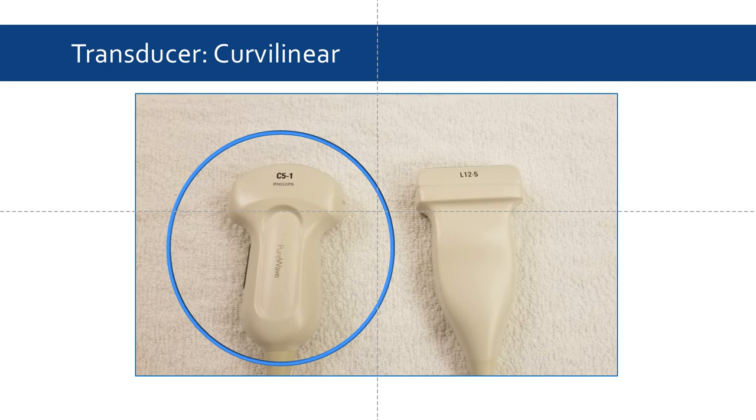When examining the hip, a curvilinear probe should be used under the MSK preset. A curvilinear probe uses lower frequency ultrasound, allowing deep penetration and a wide depth of field, which is excellent for viewing the hip structures. If a curvilinear probe is not available, a linear probe, which tends to give better resolution, can be used on thinner patients. However, the majority of the time, the curvilinear is our go-to probe.